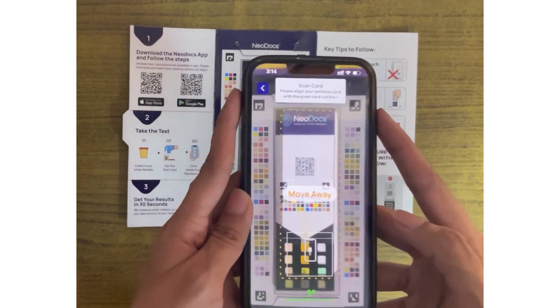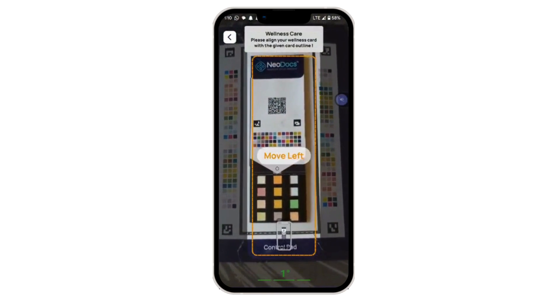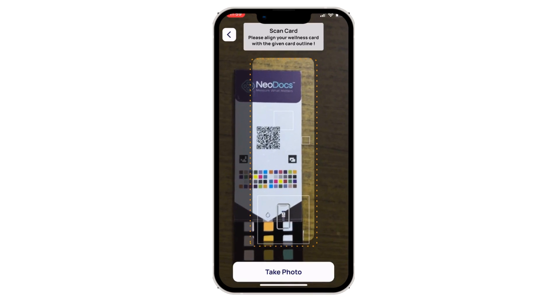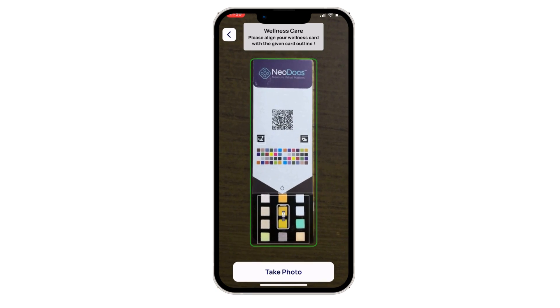The Neodocs app will itself capture a picture after the 60-second timer ends. Move your phone left or right to correctly take a stable picture as guided by the app. In case you are unable to capture the test card, please click the picture manually using the button given below.